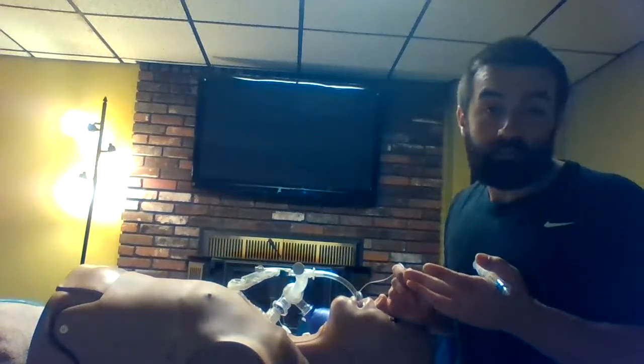So with the leaky cuff, if it doesn't respond to that initial inflation, there's a few things that could be going wrong. First and foremost, the worst: a blown cuff, whether that had a tiny little tear or something happened. Cuffs blow or can end up separating, and that's a problem because there's no way to fix that, unfortunately.